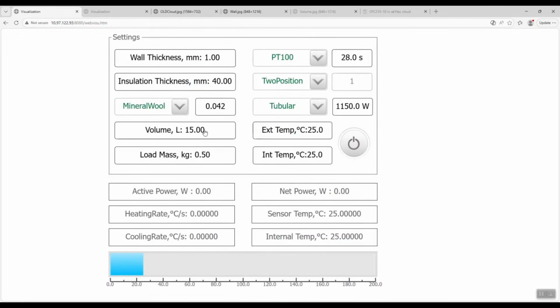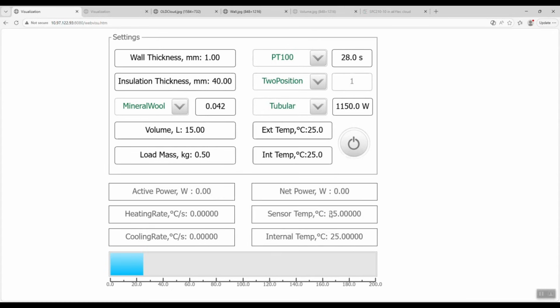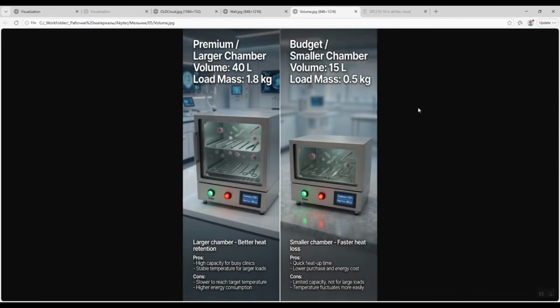The fourth parameter of the emulator is the volume of the sterilizer chamber, which we can set from 10 to 500 liters. The fifth parameter is the mass of the metal instruments to be sterilized, which the end user loads into the chamber for disinfection. Let's see how these parameters affect the process.